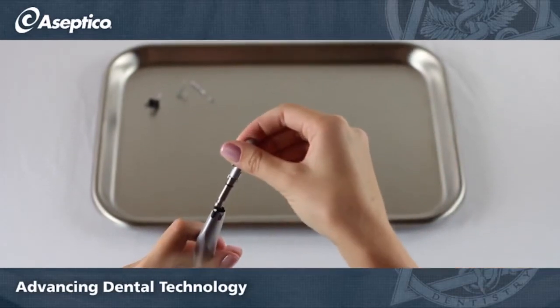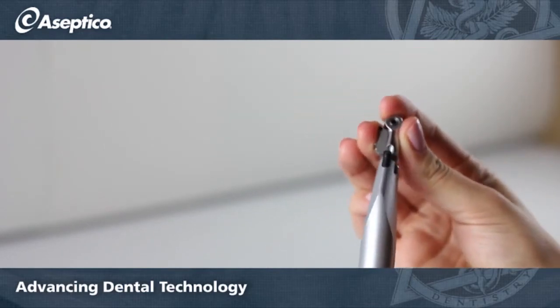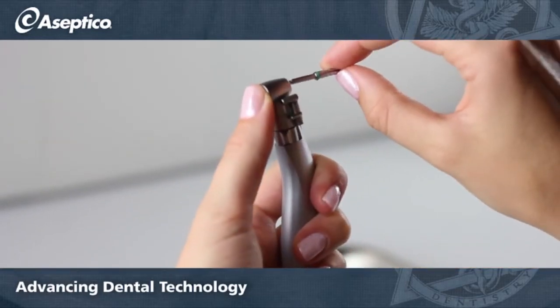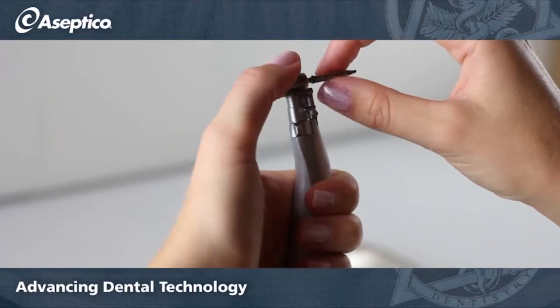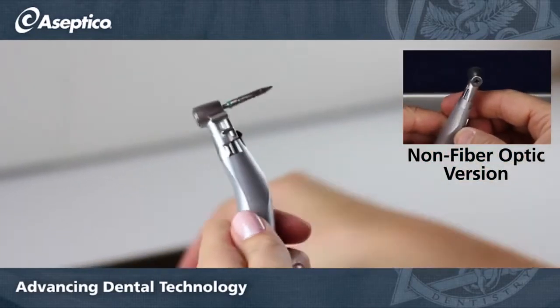Make sure that the head lines up with the body, then gently push the head down. If the head doesn't go down all the way, you can place a burr and rotate it while pushing down on the head. Rotate the neck so it is flush with the handpiece to lock the head in place.